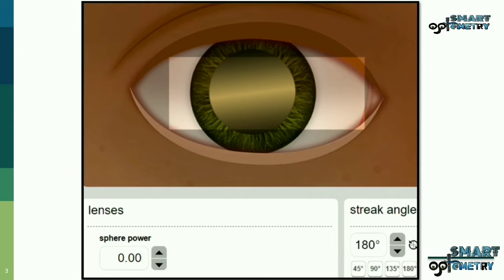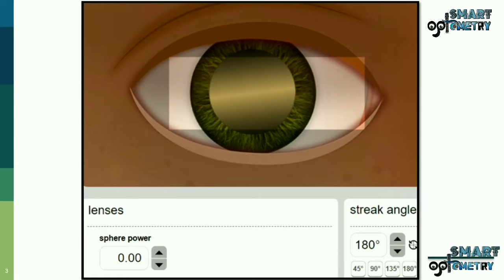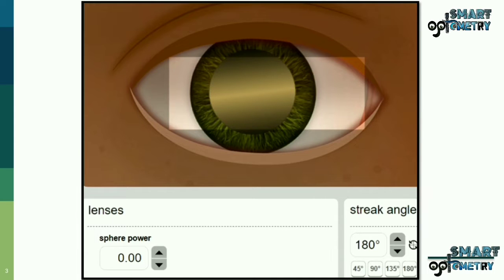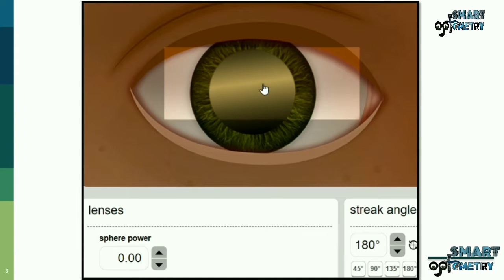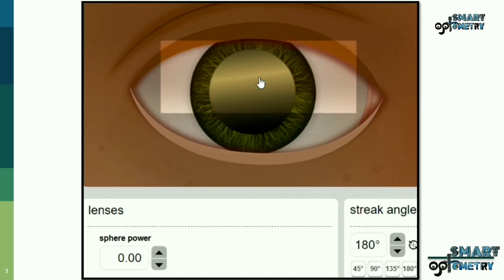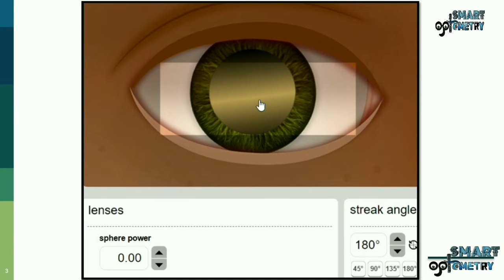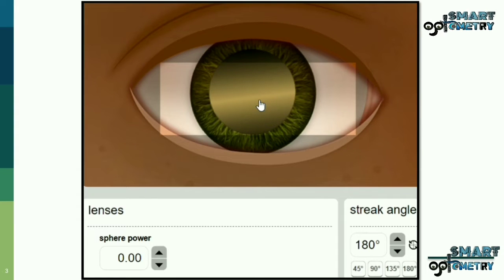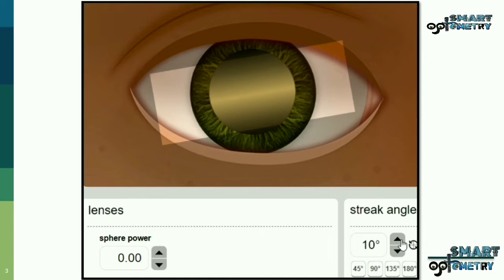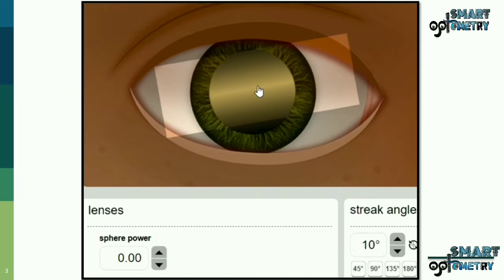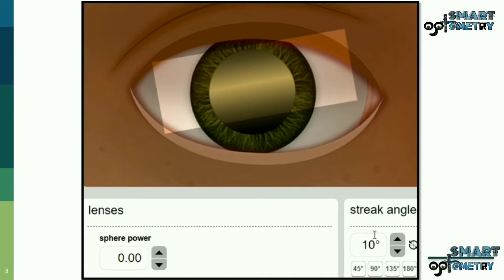This is our patient and we will neutralize this patient's refractive error using the cross retinoscopy method. First, let's find the principal meridian. Here, as you can see, the retinoscopic reflex is not superimposing with the retinal reflex, so we have to rotate the retinoscopic reflex until it gets superimposed with the retinal reflex. This is our one principal meridian, at 10 degrees.